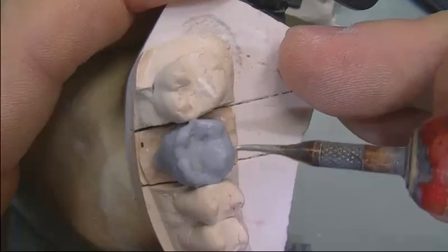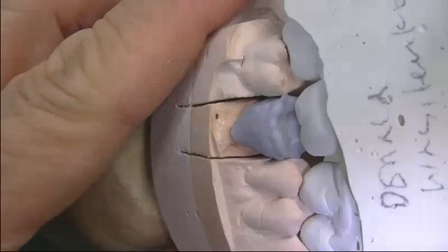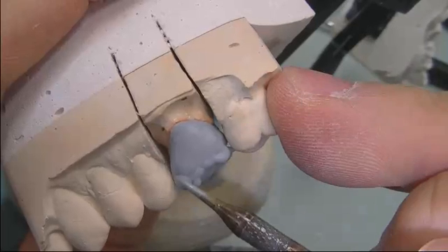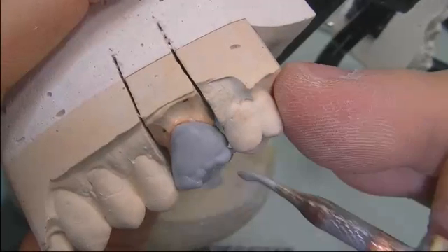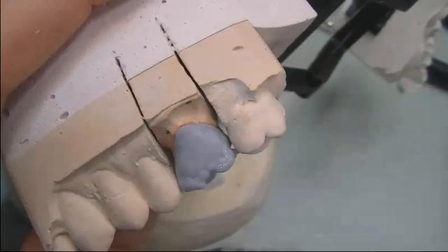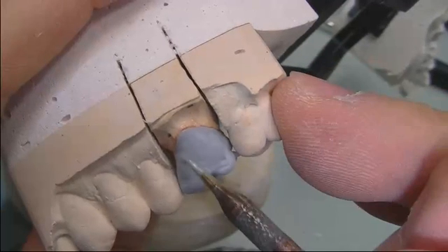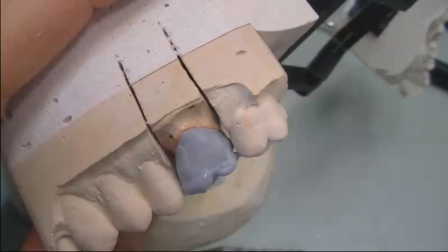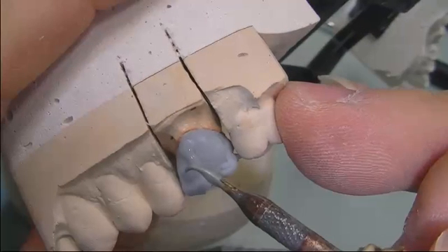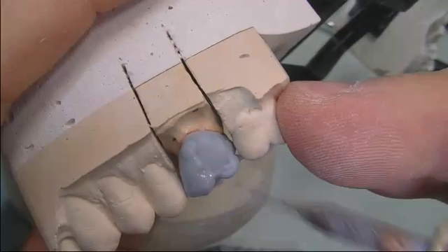We need to work here and cannot move — if it shifts, we lose working space. So we continue on the buccal surface, and now the distal.